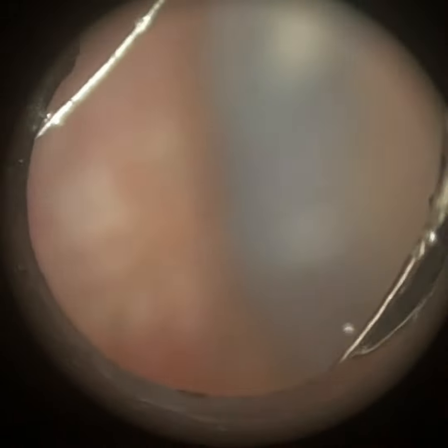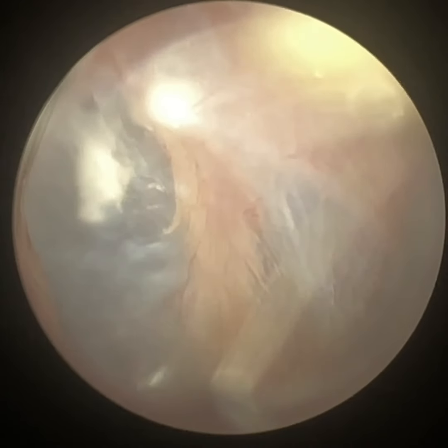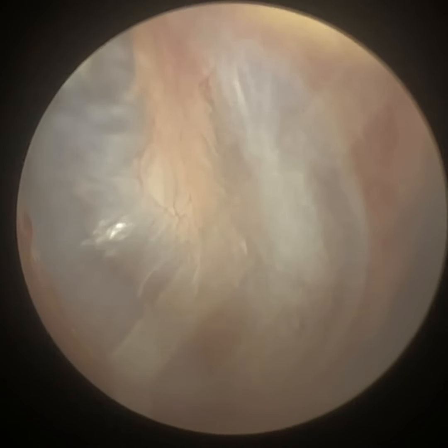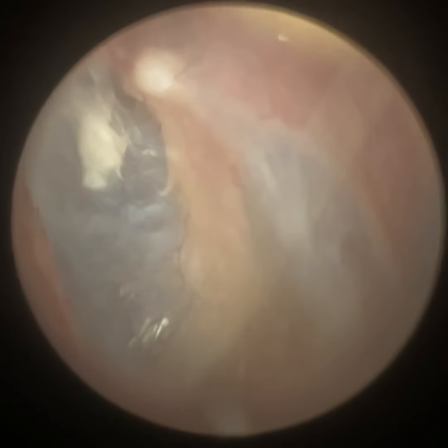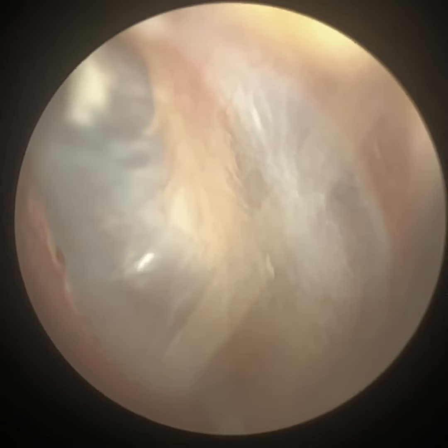We're just going to re-enter the ear and get the eardrum in focus. You'll see there's a bit of myringosclerosis — calcification of the eardrum in the anterior superior quadrant, so north or west. Otherwise the eardrum looks pretty healthy. Then we're going to move on to the patient's right side — I'm just increasing the brightness.